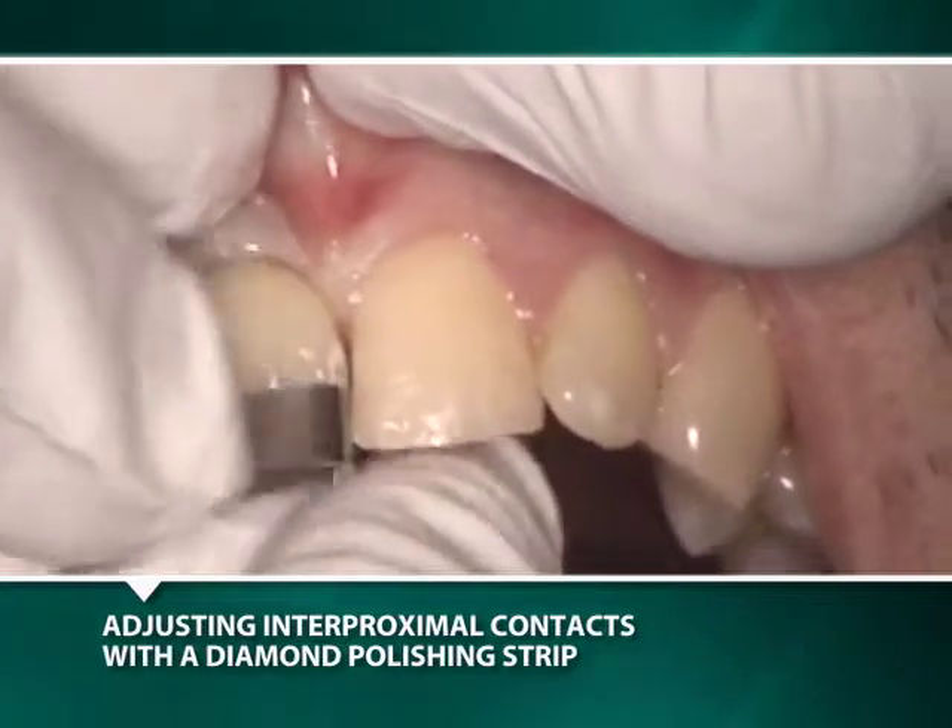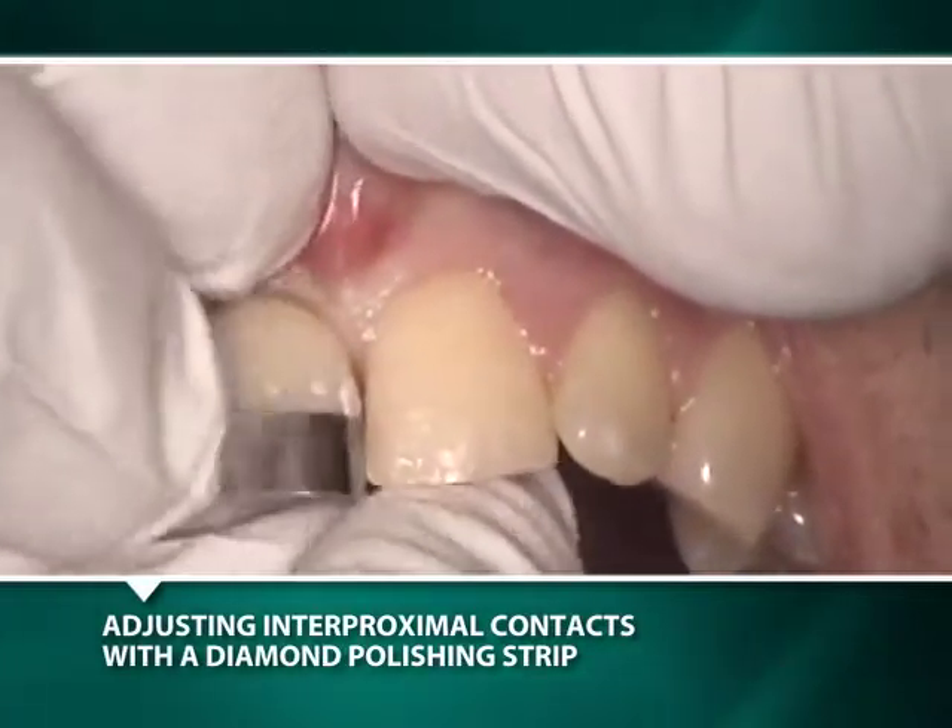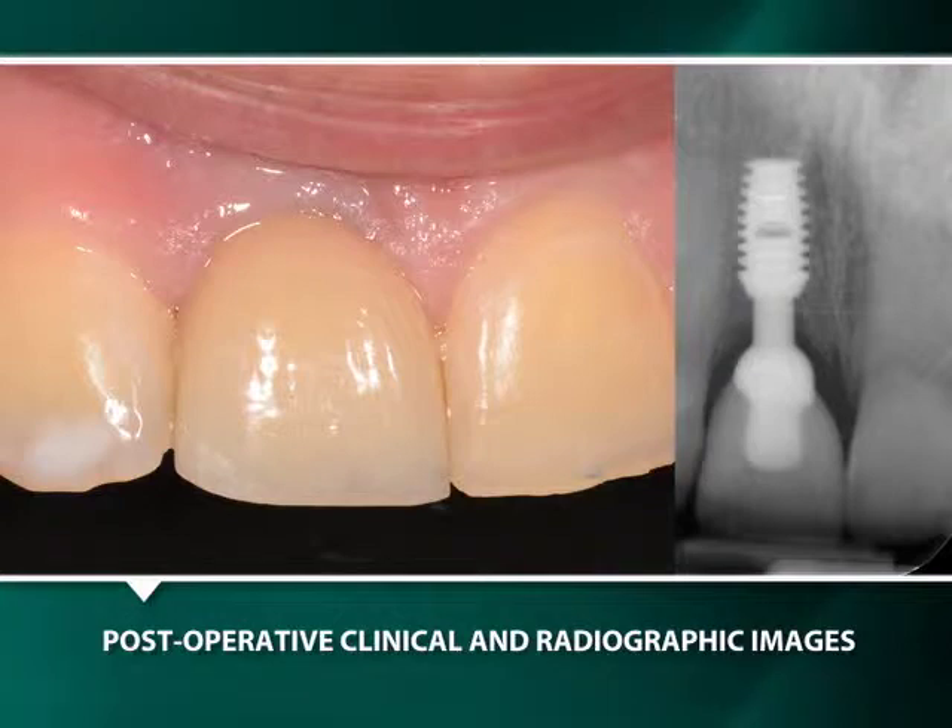A diamond polishing strip was used to establish a passive interproximal contact. Post-insertion clinical and radiographic images reveal an aesthetically and functionally restored implant.